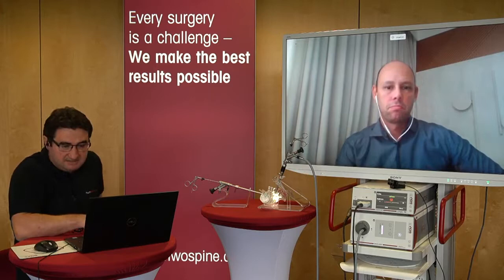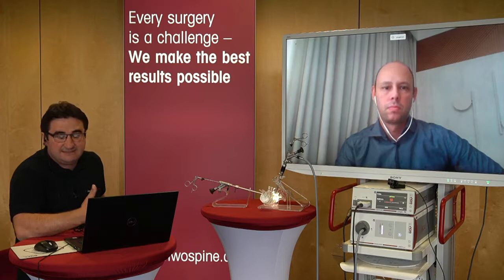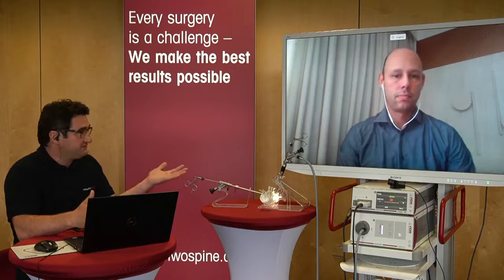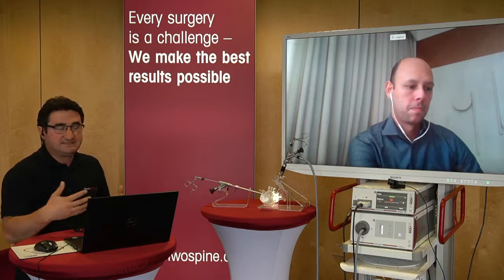No problem. I can comment on this also from my experience. Usually the dural tears are not bigger than 2 millimeters during endoscopic surgery, but of course it depends on the size of the dural tear. If you see the fibers aggressively coming out, and there is no chance to continue, you can switch to open surgery and repair it. But as you told us, usually they are very small, but again you can see some fibers coming out. At that moment there's a trick: you can stop the irrigation, put the fibers back inside the dura with the dissector, and then continue the operation. After the operation, it's possible to put some barriers on the dura and leave it like that.